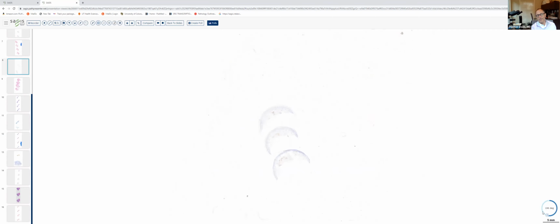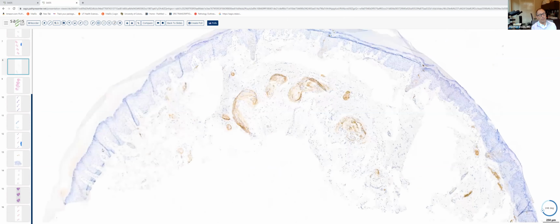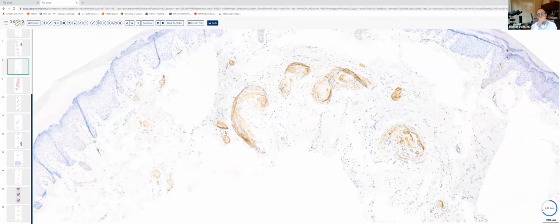This is an immunohistochemical stain, and one can tell that because it looks kind of like black and white television. In immunohistochemical stains, the epidermis is going to be kind of this blue or blue-gray color, as is most of the tissue. In this particular instance, we use a fluorescein-tagged antibody. This is a brown, not fluorescein, this is a brown chromogen. This is a DAB-tagged antibody.